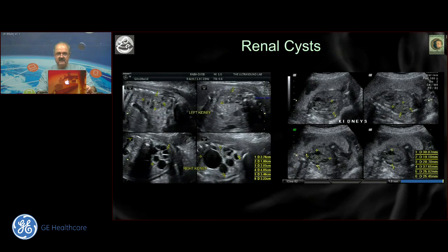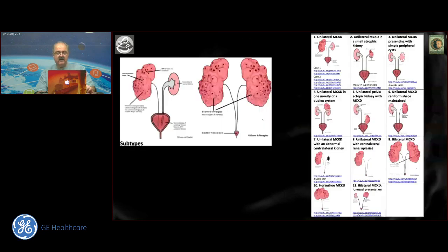That there are large cystic spaces outside on the periphery, and that is what looks abnormal. If you do a casual glance, you will never pick this up. But if you're aware of the condition, you will always pick this up, and that becomes useful because it has a tremendous bearing on the outcome. Remember that we had a wonderful old classification of the multicystic kidney by Simon Meir, which he prepared for ISUOG, where he mentioned that you must look at the other kidney always very carefully, because therein lies the prognosis.